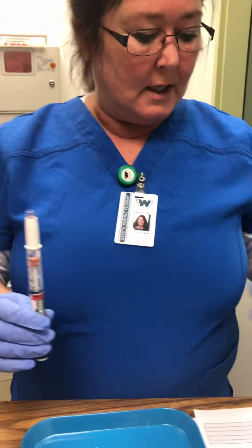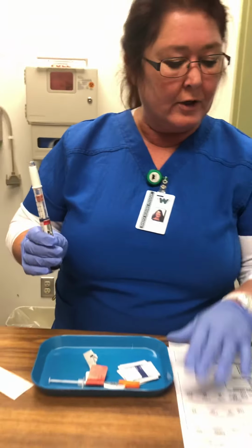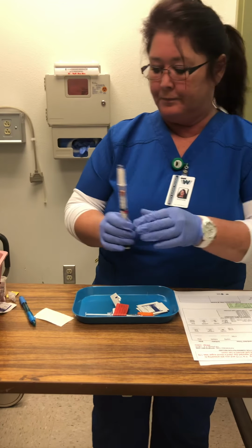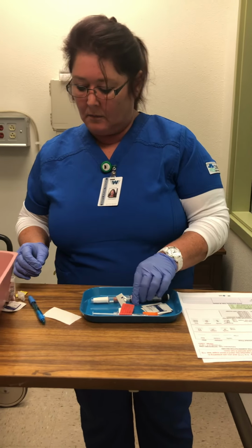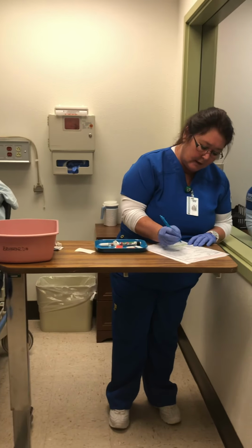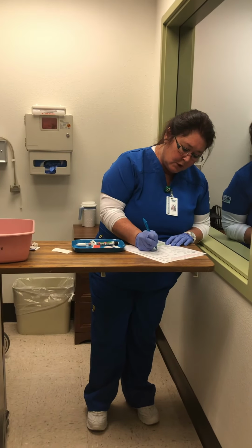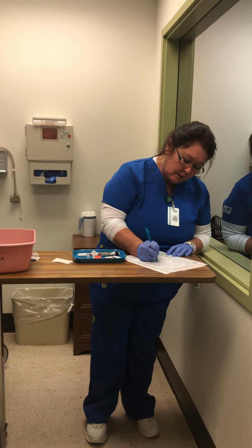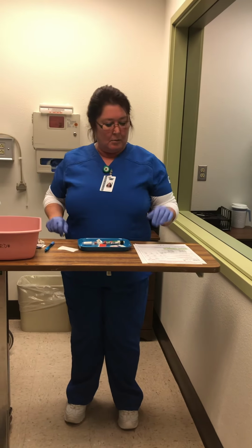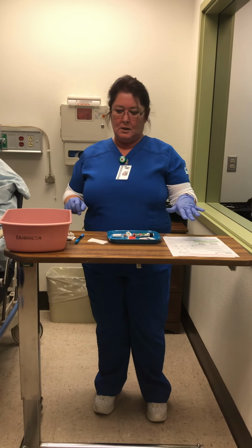Because on the sliding scale, it shows with the 178 glucose that I need to give her 2 units. Okay. So now that I've done that, I'm actually going to write on her blood sugar record that I've got 178 with 2 units.